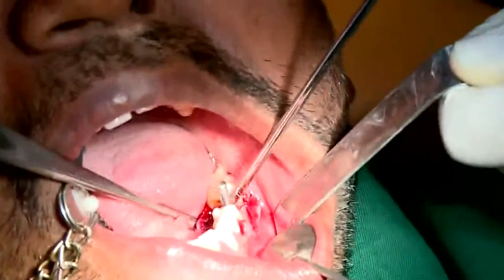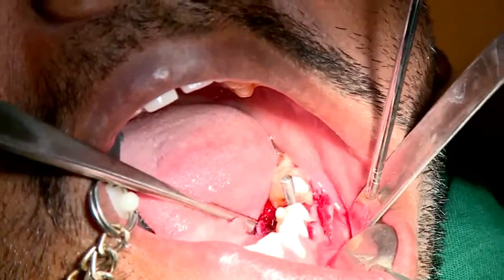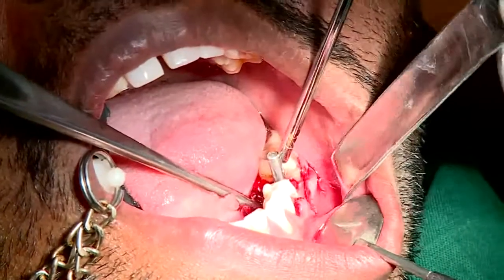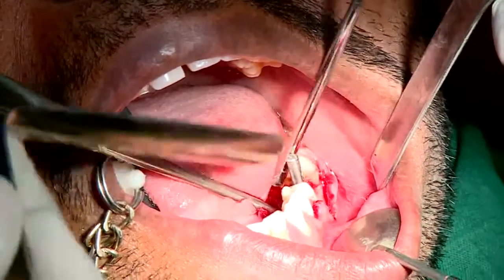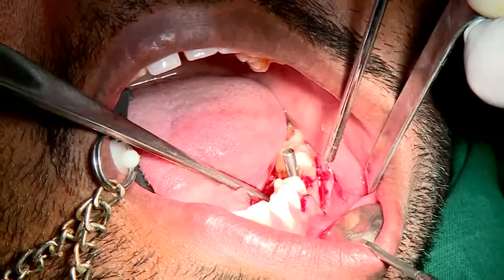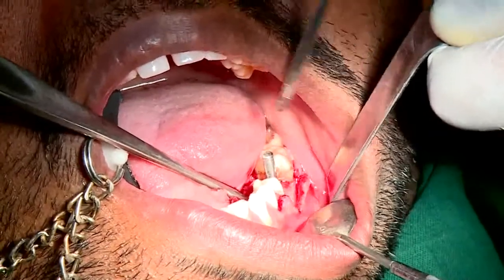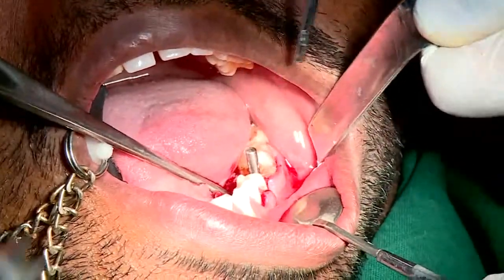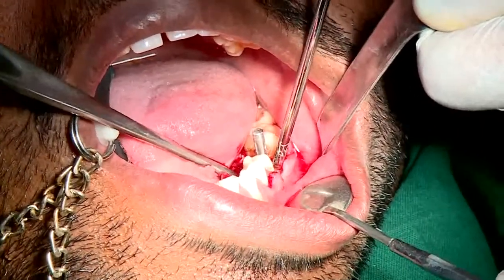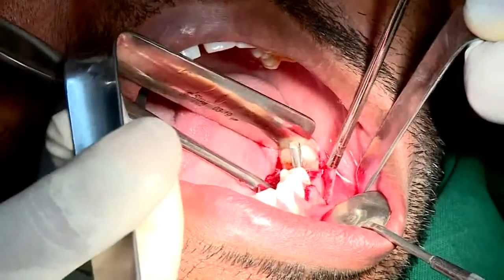This is what we call a paralleling pin. Particularly when you are doing multiple implants, these implants have to be parallel to each other. Now if you see the inclination of it, it's neither too lingual nor too buccal. That is the mediolateral direction. In the anteroposterior direction, it's neither inclining too much towards the premolar nor away from it.